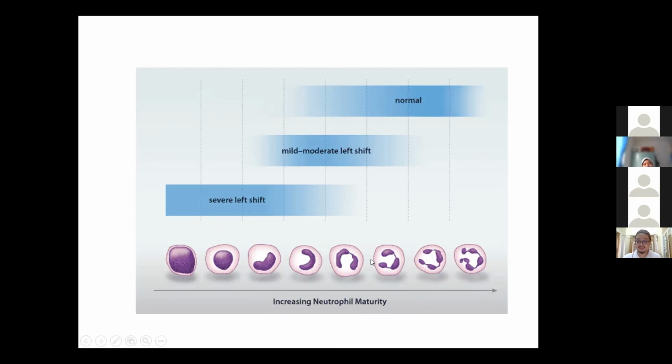Yeah, so this variation, the kind like this, is normal in the adult population. Here, normal but in small quantity, not too many. So when you see that the number of band neutrophils is too many in an adult person, you start to be worried, and you start to think about what could be the cause of this increase. But if it's a few, don't be too alarmed. If I find one and immediately call people that this person has got something wrong. No, 1 or 2 is okay.